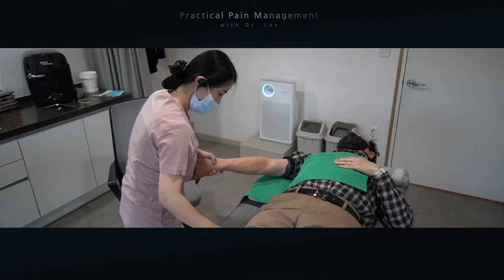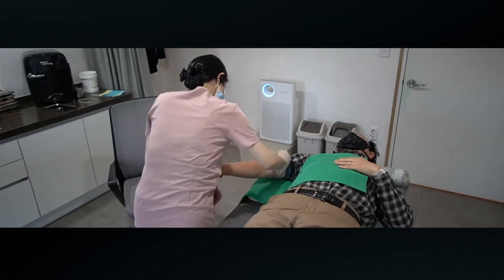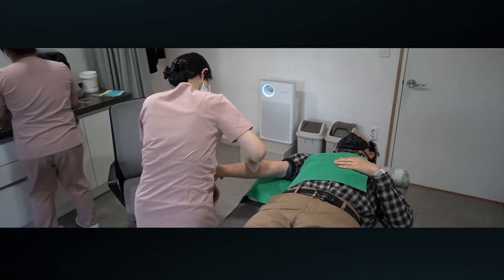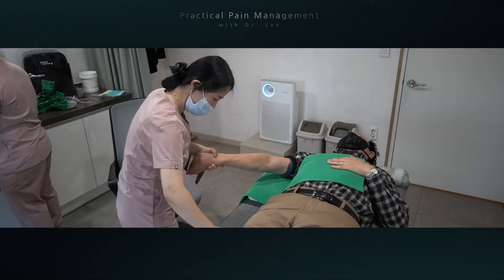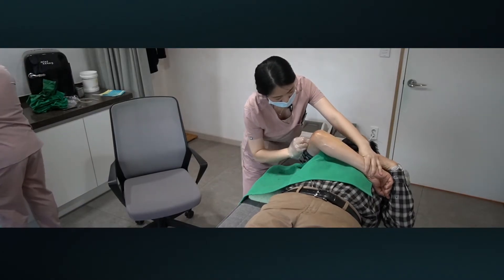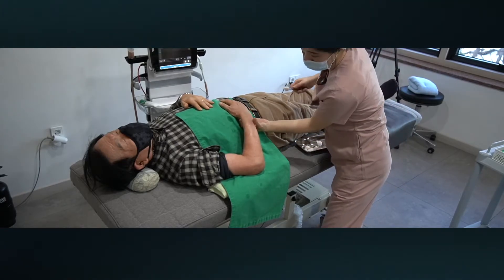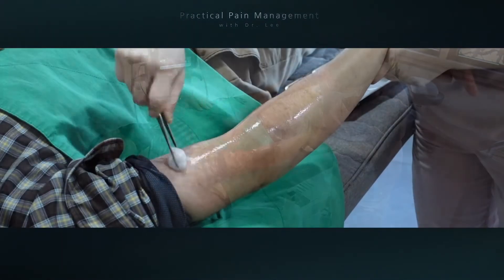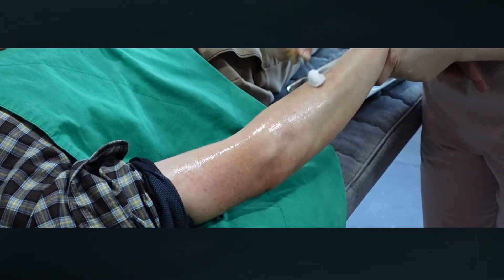Please watch my steps — notice how carefully we clean the surgical site. We should try to sterilize the surgical site once more. We do every procedure to make infection risk zero. Watch carefully every step that we do before the injection procedure each time.